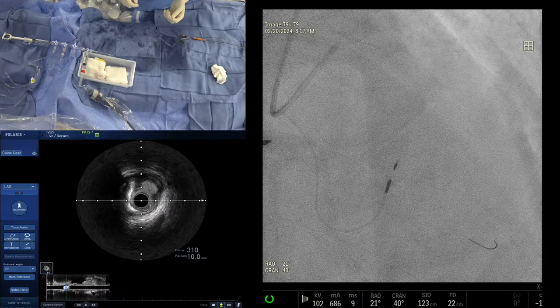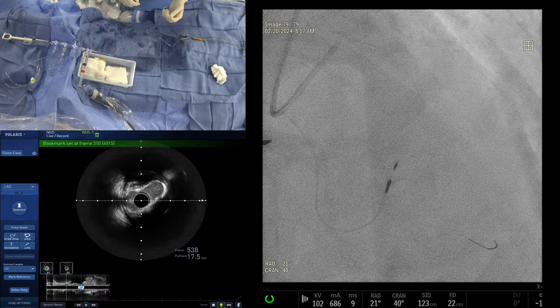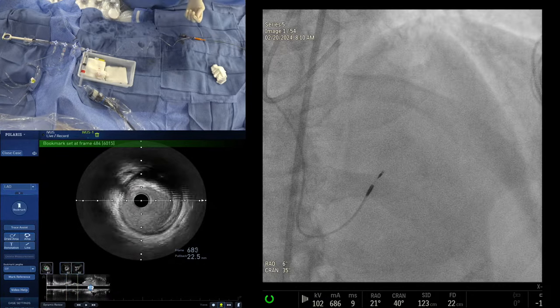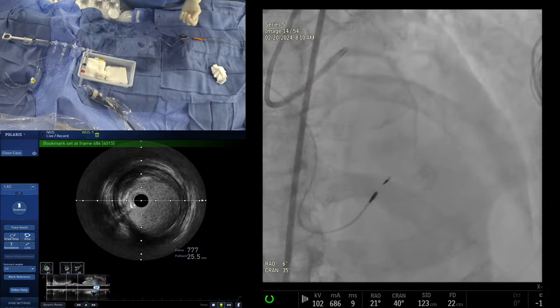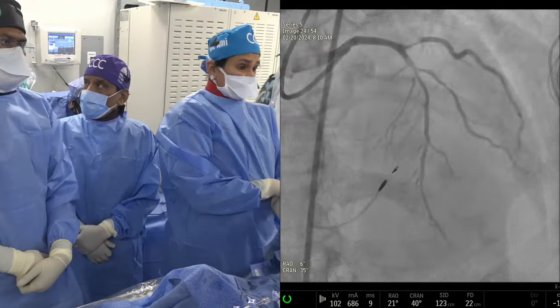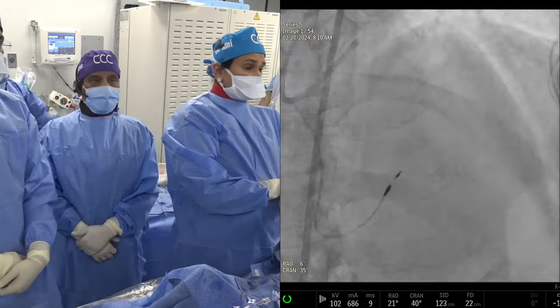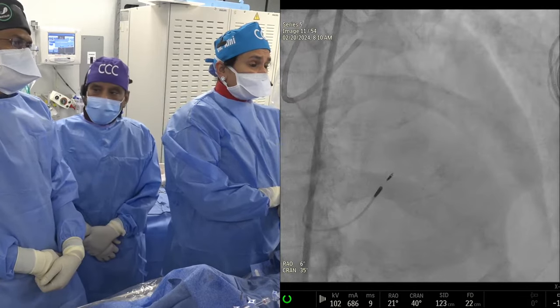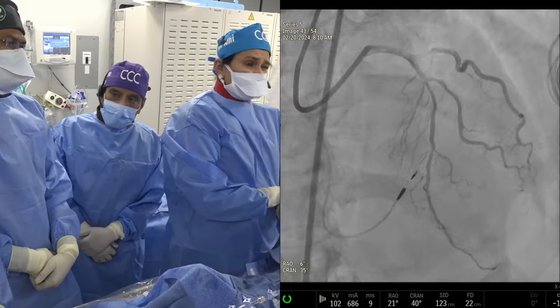Play your angiogram. So we'll wire the diag, right? Play. Okay. Yeah, good. Let's play it. Okay, wire the diag. Okay, both D1, D2? Mm-hmm. Okay, and then? Let us pre-dilate. Let us have a 3-0, right? 3-0 for the LAD and 2.25 for the?